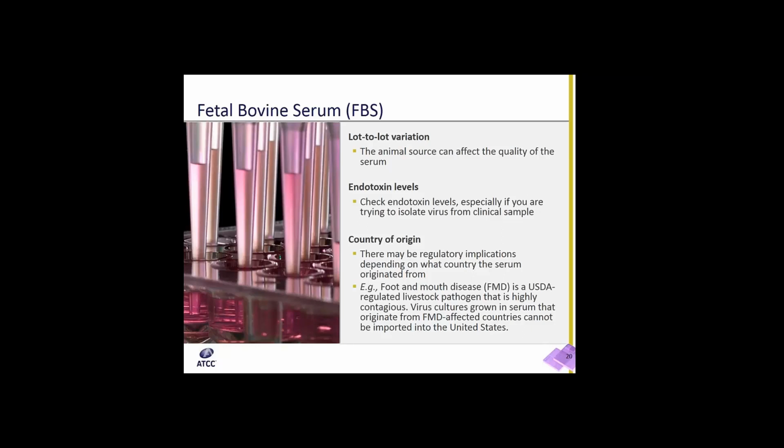As an example, there is foot and mouth disease. This is a USDA-regulated livestock pathogen. It's highly contagious. And so virus cultures that are grown in serum that originated from FMD-affected countries cannot be imported into the United States. The other agent to pay attention to is the agent responsible for bovine spongiform encephalopathy, which is called BSE.